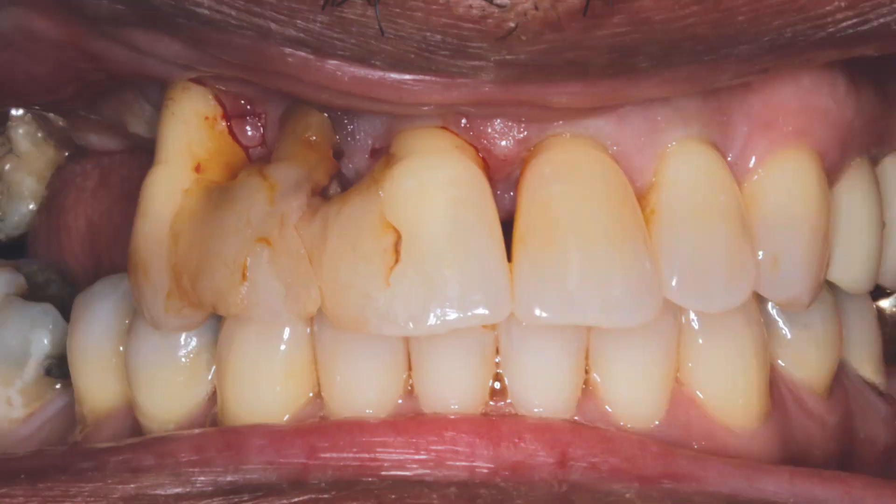The chief complaint for my patient Weldon was missing teeth and gaps between his teeth. The preoperative evaluation showed periodontally involved and non-restorable maxillary right teeth number 2 through 8 with significant periodontal bone loss, which would need to be addressed. The periodontal condition was stable in the patient's left maxilla and he was satisfied with the existing aesthetics in that quadrant, so we were concentrating on the maxillary right quadrant.